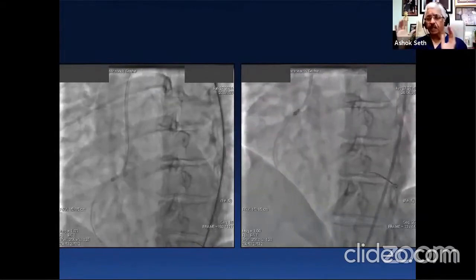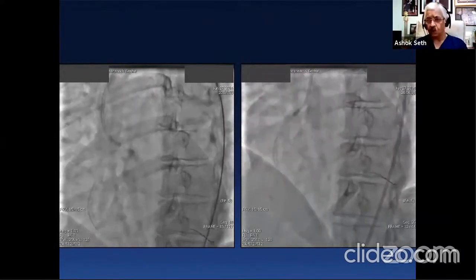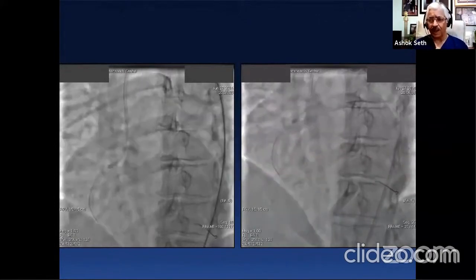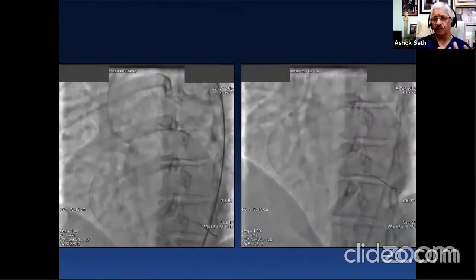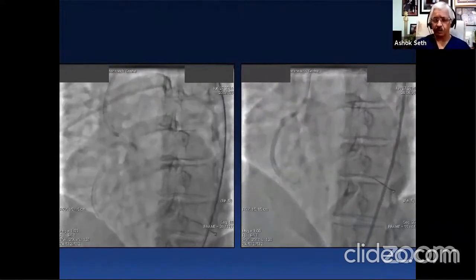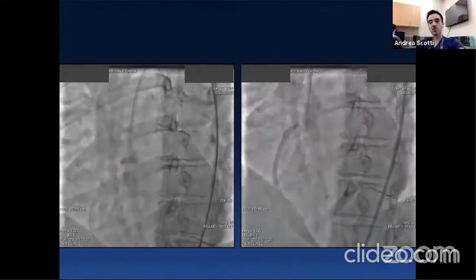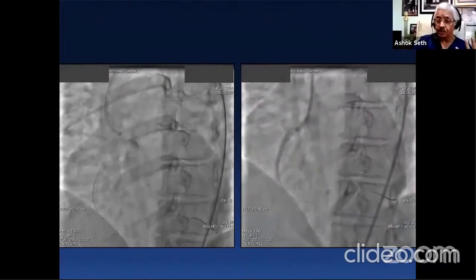There are two aspects. There are those who are asymptomatic, who you want to assess through nuclear scans, those who are symptomatic but don't have disease processes and therefore normal or normal-looking arteries, and then those with coronary artery disease. The coronary artery disease may have some role for FFRs, the others don't. And about angio-CT, what do you think? Well, angio-CT has a huge role.